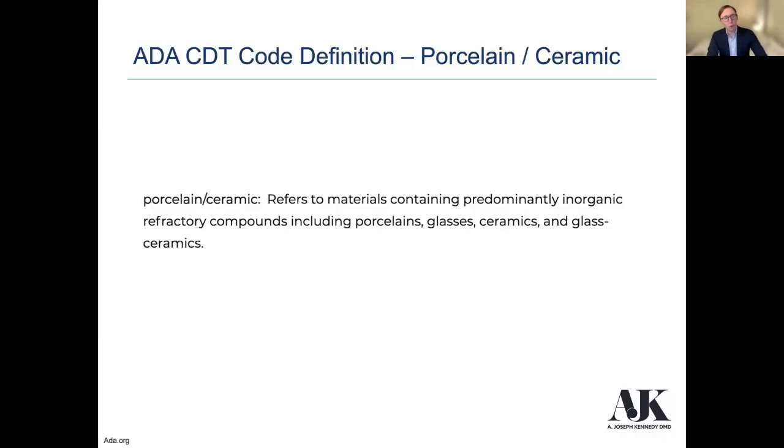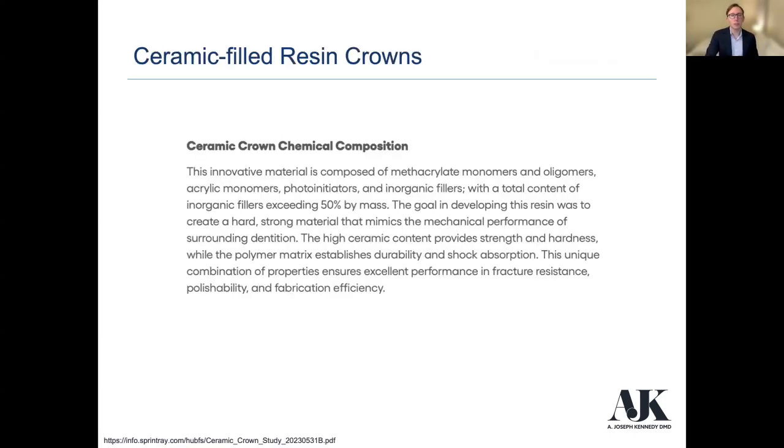So why am I talking about boring CDT codes at 7:45 on a Tuesday night? That's a great question. But the reality is that the ADA changed their CDT code definition for porcelain ceramic, where they removed a little bit of it. And so it currently reads that it refers to materials containing predominantly inorganic refractory compounds, which are porcelains, glasses, ceramics, and glass ceramics. So now we can think about, does this material that we're printing or milling predominantly contain inorganic refractory compounds? And if so, that would, in theory, fall under this definition for porcelain ceramic.